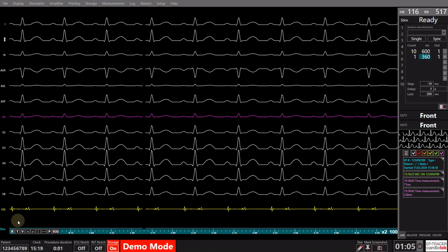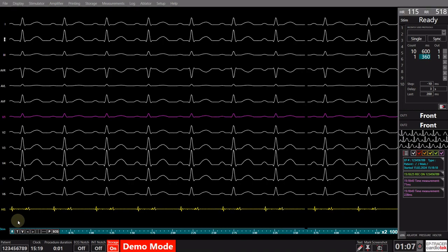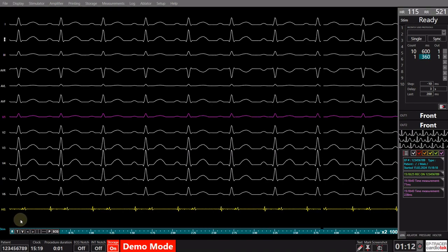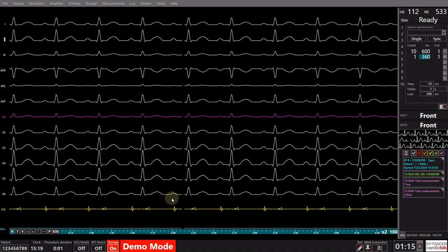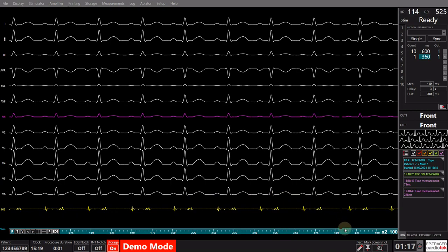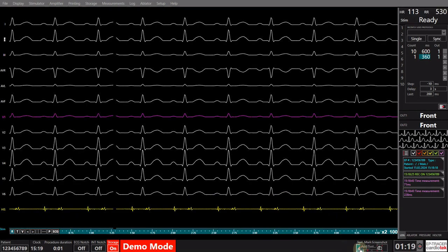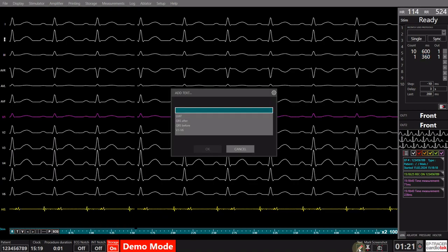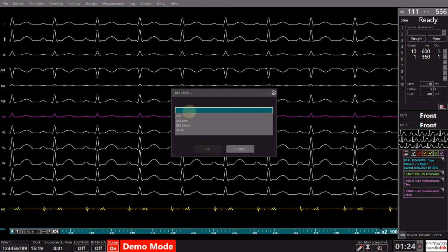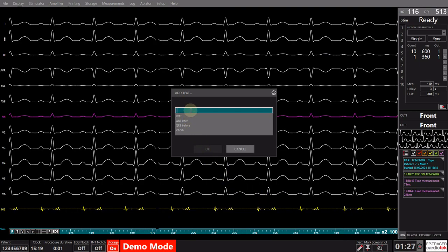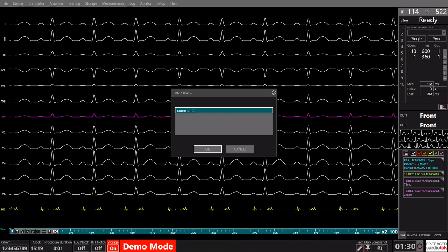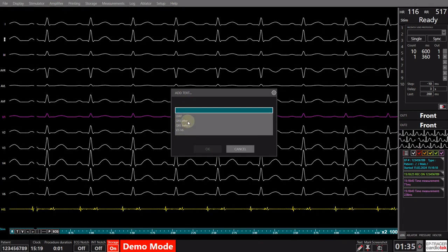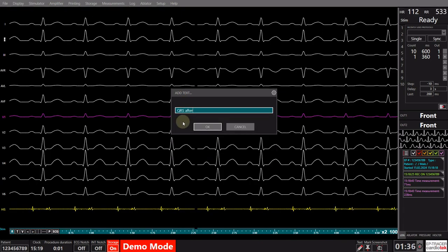Throughout the operation, users have the option to insert comments at various stages of the procedure, facilitating the inclusion of remarks. This is accomplished either by selecting the designated button located in the lower right corner of the screen, or by using the keyboard shortcut F3. Upon activation, a display window will pop up, allowing the input of free-form text. Additionally, there is the option to establish predefined text entries, enhancing the standardization of interventions.